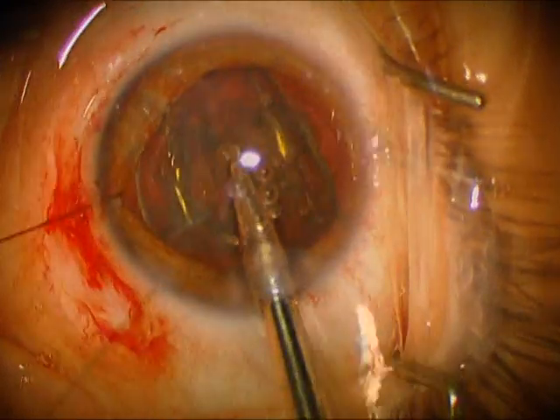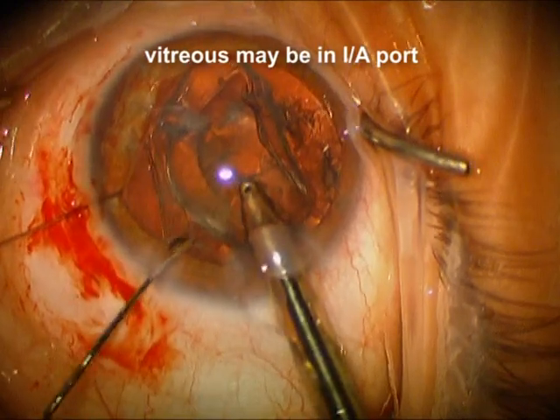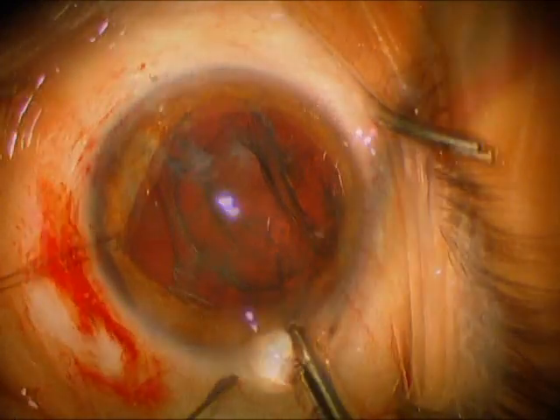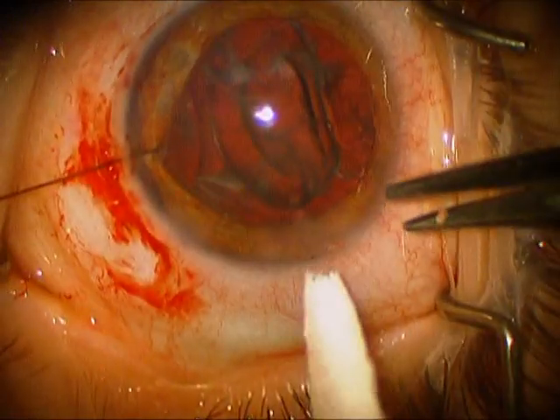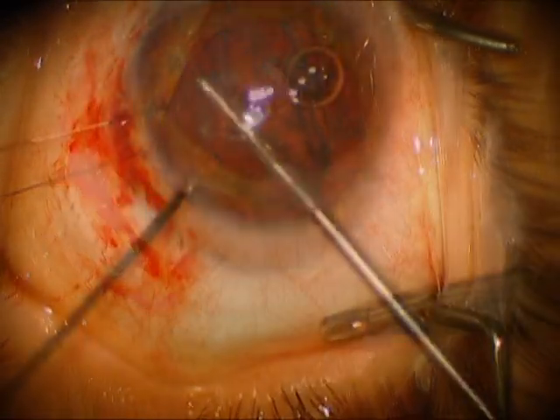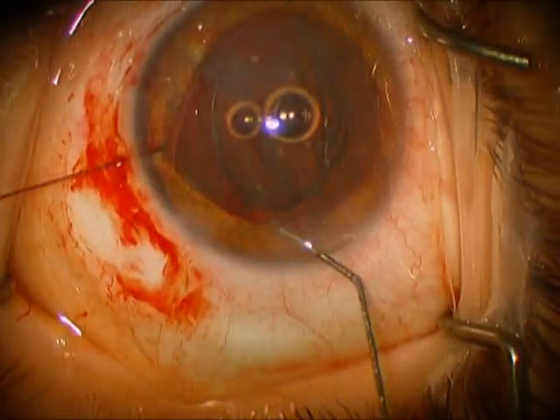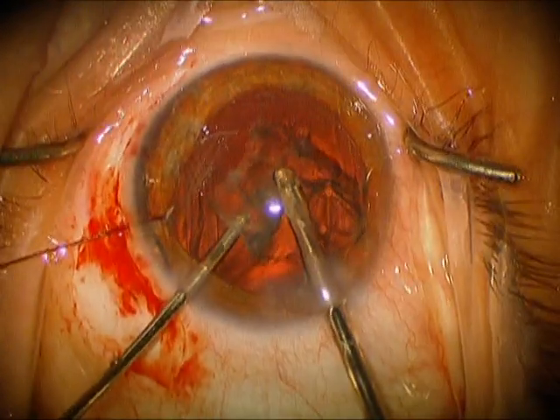Now we're using the irrigation aspiration unit, and we're removing this soft lens. As you can see, we caught some vitreous here which has come around the weak zonules, and so we're going to end up finishing this up with the anterior vitrectomy instrument. We placed some stain here, and we're removing any residual vitreous that we detect in that area.